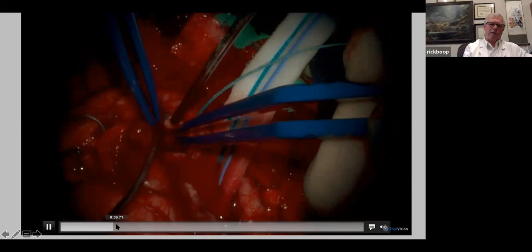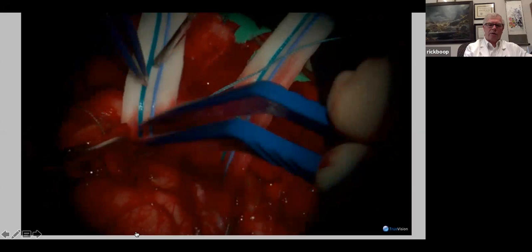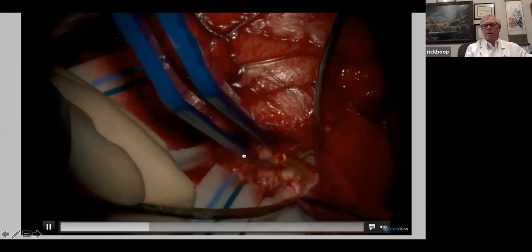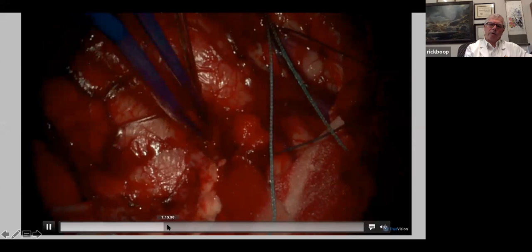And then we cut the catheters off flush with the cortex so that if there's any settling of the brain, any shift as we work, the catheters tell us the relationship between the surface of the brain and the depth of the tumor. And we can follow these catheters down to the depth of the catheter and know when we get to the limits of the tumor if it's starting to blend with adjacent brain. You see us taking the catheter out as we work circumferentially around the tumor. In this case, it extended down to the Sylvian fissure.